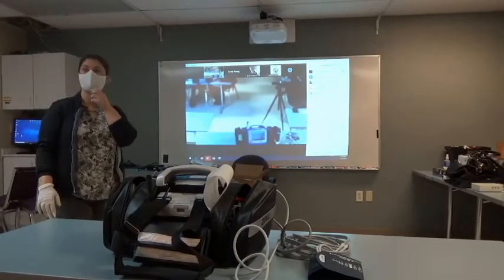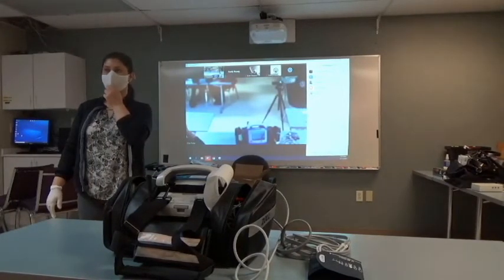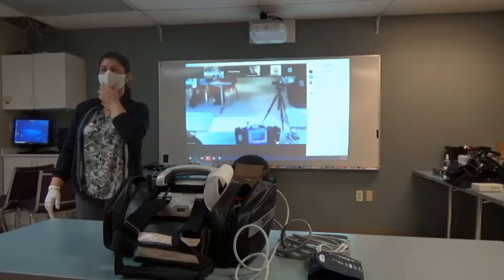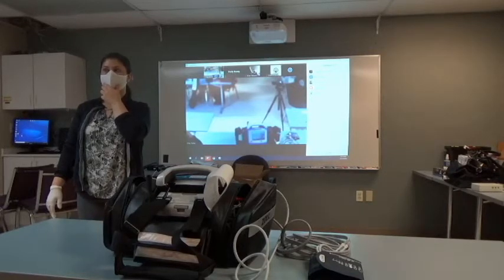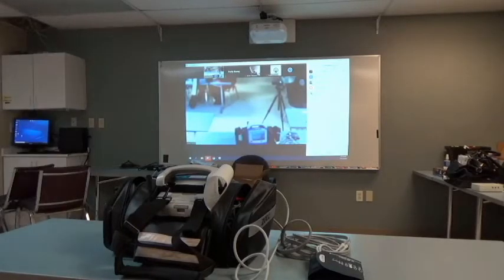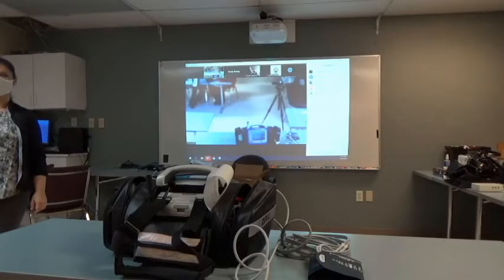While we're talking about 12 leads, we need to get in service tomorrow, similar to what we did with the Phillips. I'd like to get a 12 lead on every patient, just so we increase our proficiency with the device and the navigation of the buttons. If it's a patient that you don't think needs a 12 lead, please just tell them why you're doing it. We're requiring this for training for us. It's a new device. Would you mind if we get a 12 lead on you just to help us out?